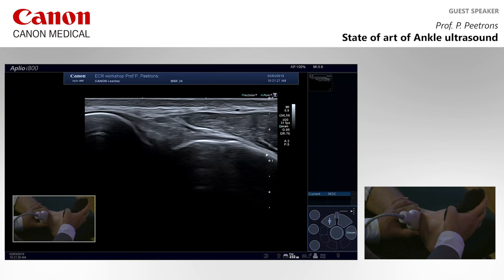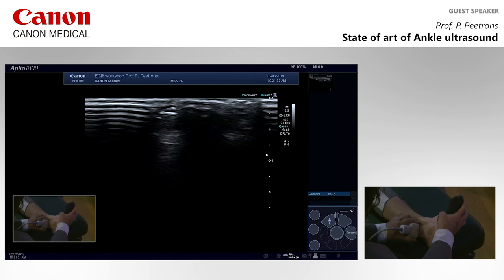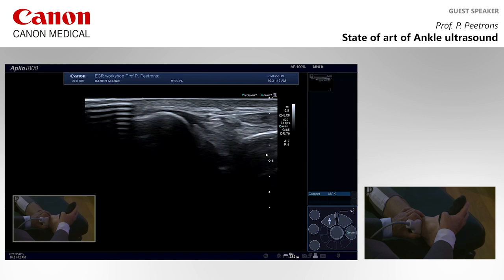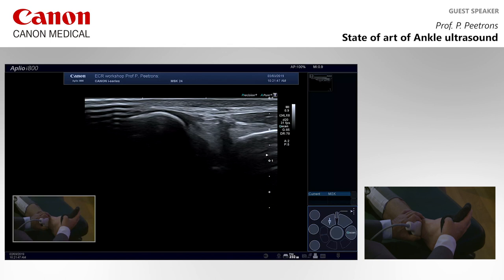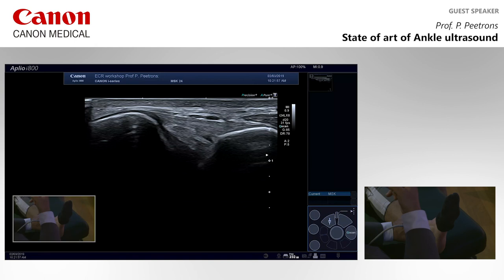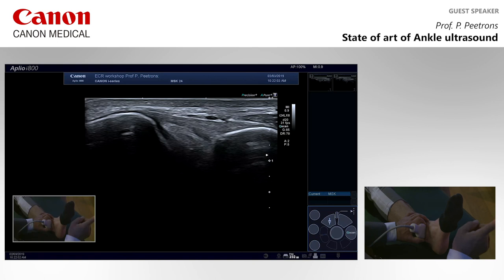I will do it myself, and sometimes you can see a little difference. I'm sorry, I need a little bit more. Voila. So this is without tension, and this is with tension. And you see the ligament better with tension, of course, than without. So if you don't see the ligament very clearly, don't forget to put the foot in dorsal flexion. So we push the talus towards the tibia and the fibula, and you see much better the lines of the anterior tibiofibular ligament.